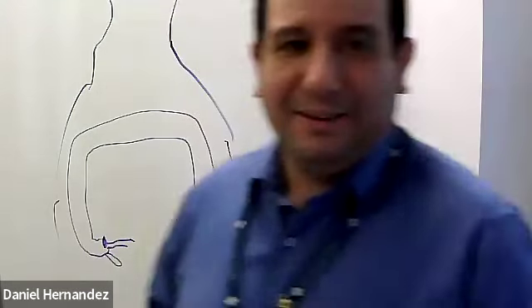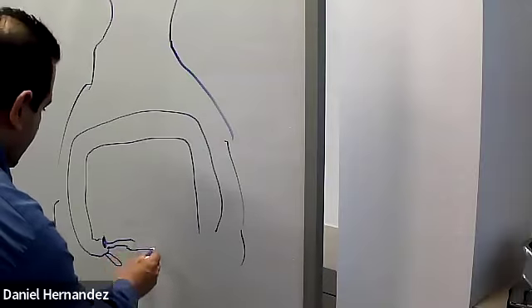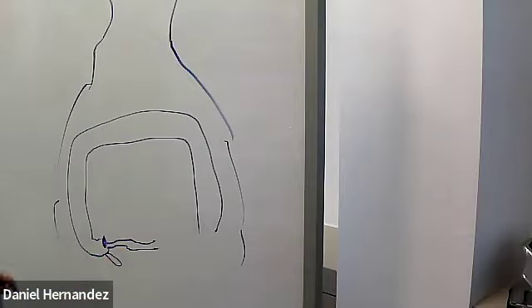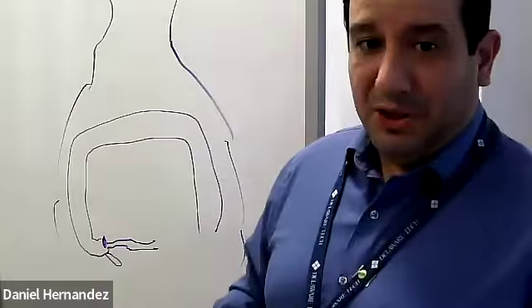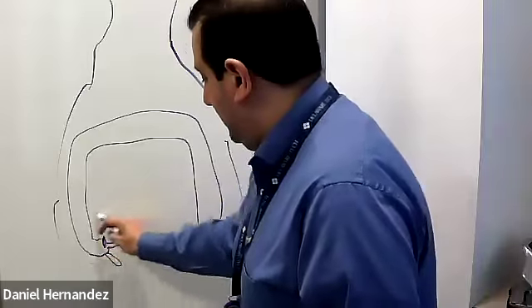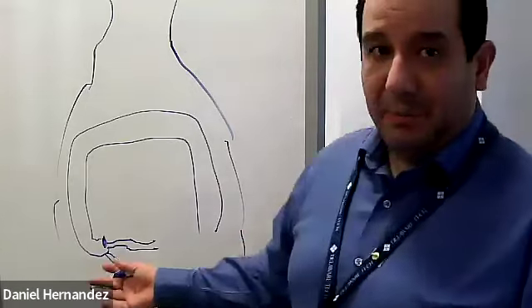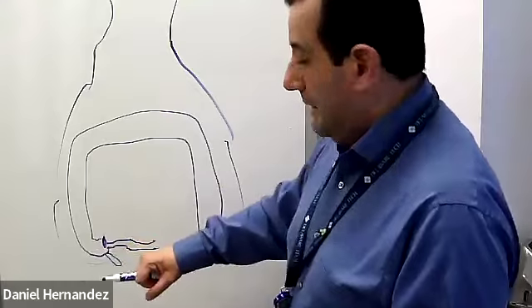That right lower quadrant is where a lot of the action happens. We're looking for the terminal ileum, the end of the small intestine where it connects into the beginning of the large intestine. Our protocol was a couple of still images, but predominantly cine clips. We start in the right lower quadrant and try to locate the ileocecal junction. If it's not visualized, at least image the right lower quadrant, a couple of transverse images, a couple of sagittal images, and then we do some sweeps.